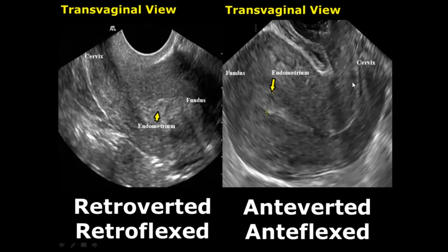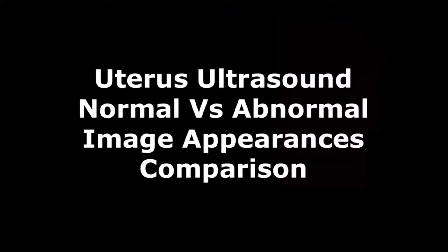Here we have the anteverted and anteflexed uterus. You can see that the fundus is on the left side of the image because it's bent facing anteriorly. The cervix is also facing upward, so it is anteverted. And the body is folded and facing anteriorly.